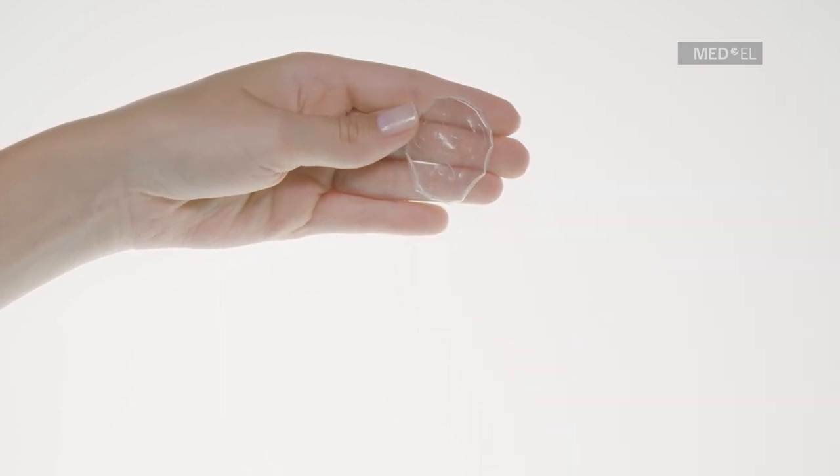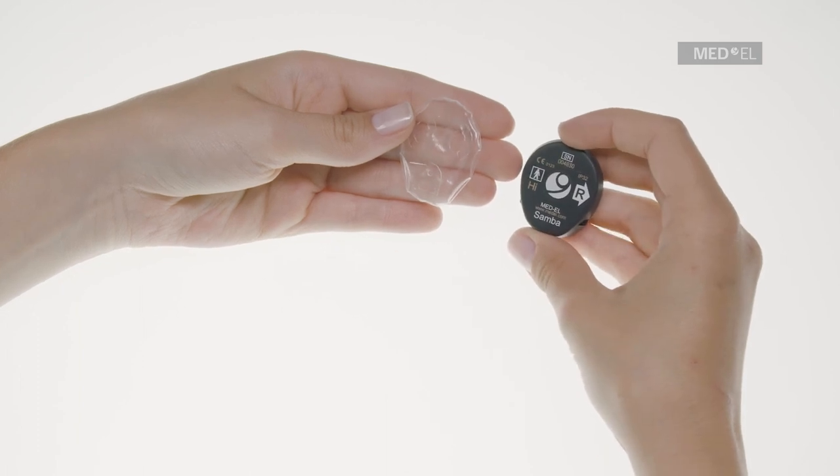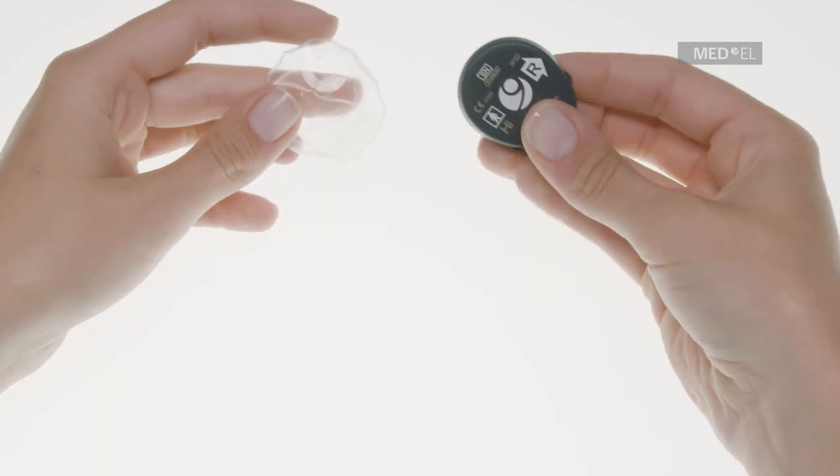Discard Waterwear if it has any damage. Remove any attachment clip from your Samba. Hold your Samba with the flat side facing up so that you can see the Medel logo.